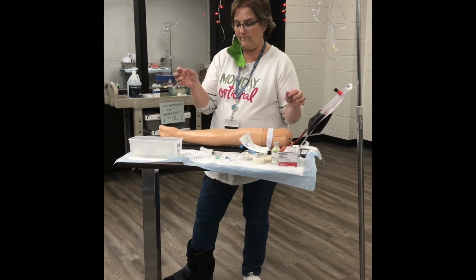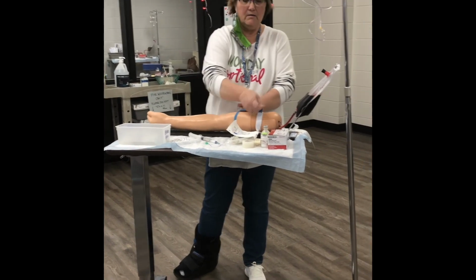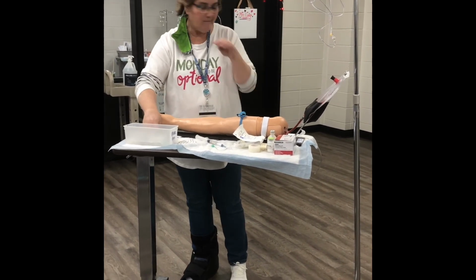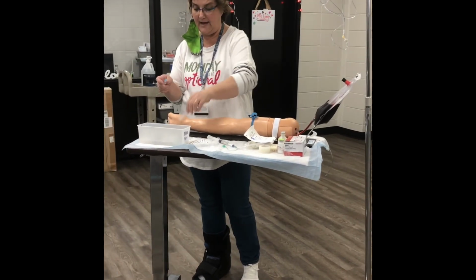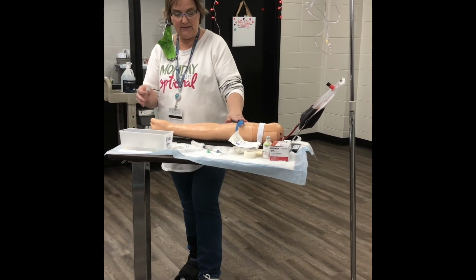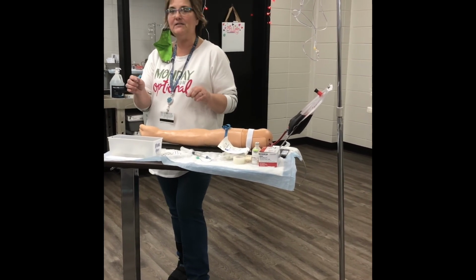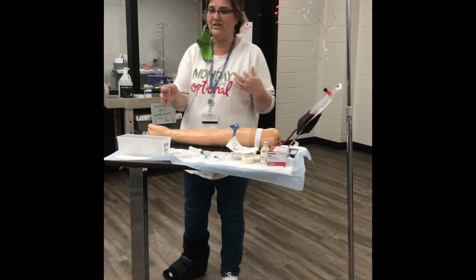All right, I'm going to put my tourniquet back on. I'm going to put my gloves on if I had any. First, there is one thing students do, and I know why: they get this on and it's clean and they're getting ready to start, and they want to touch it again and make sure it's still there. It's still there. Don't touch it. You've cleaned it, right? You can't do that. Even if you have gloves on, you can't touch it again.